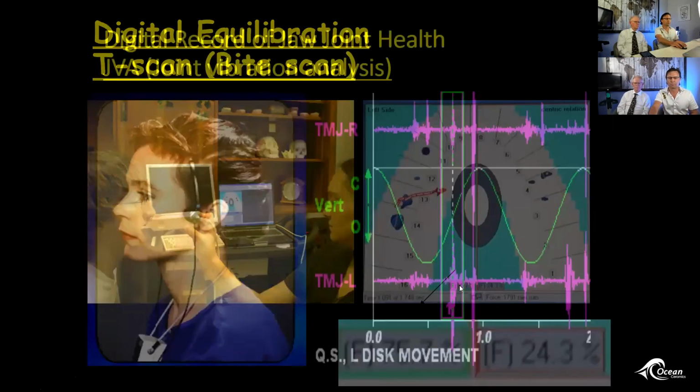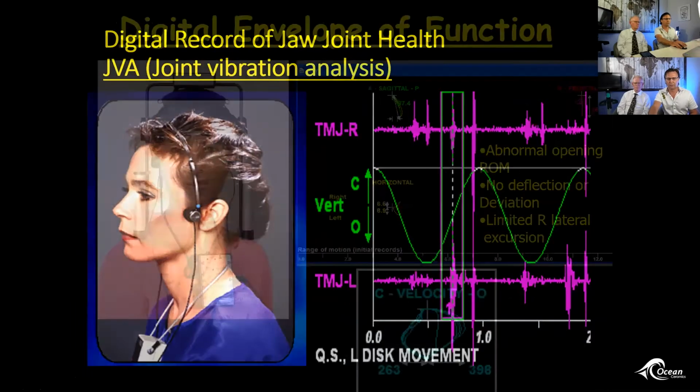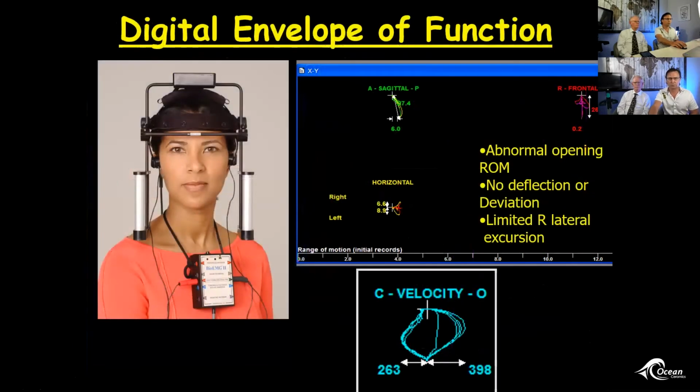Joint vibration analysis, health of the jaw joint. These are all things that we look at in our Dent 4 program. Digital envelope of function. We can actually measure the velocity of the jaw function and the path and range of motion.